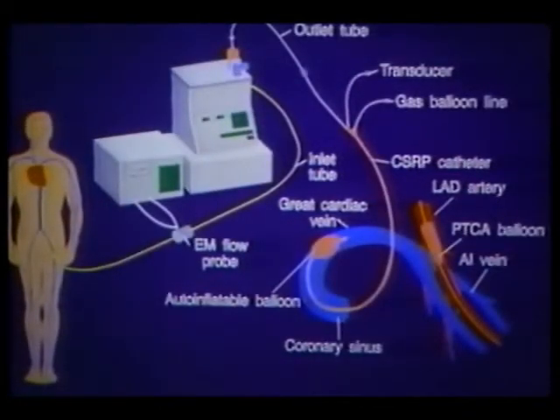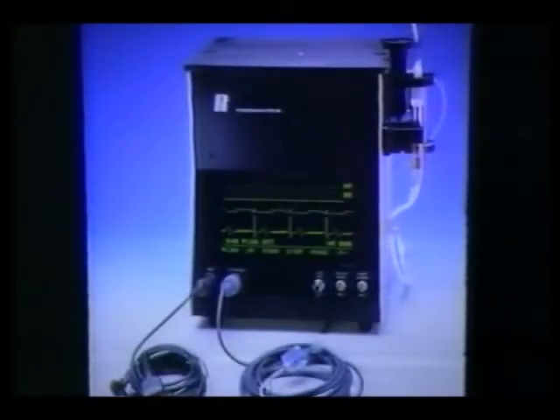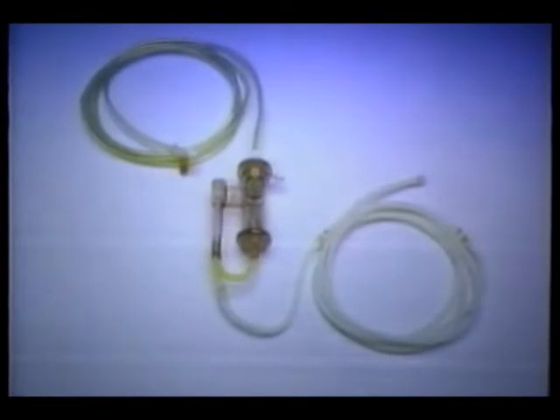Before we get on to the case, I would also like to review for you the technology of retroperfusion. Retroperfusion takes blood from a peripheral artery, in this case, on this diagram, the femoral artery, and through an ECG synchronized pump, propels the blood backward in the coronary vein to the myocardium. The heart of this system is a computerized ECG synced pump to pump only during diastole and to allow normal venous drainage during systole. The catheter is a triple lumen retroperfusion catheter with a very special design at the tip to seek out the coronary sinus, making installation easy.